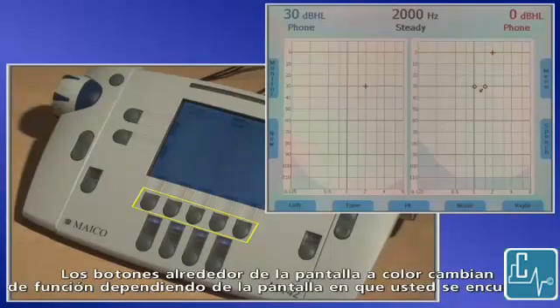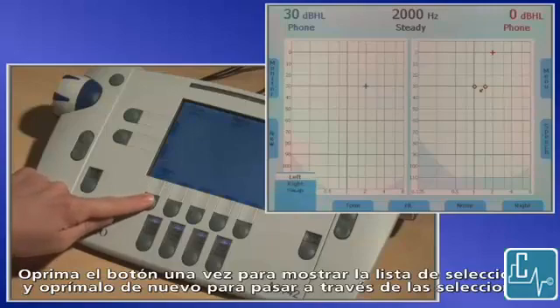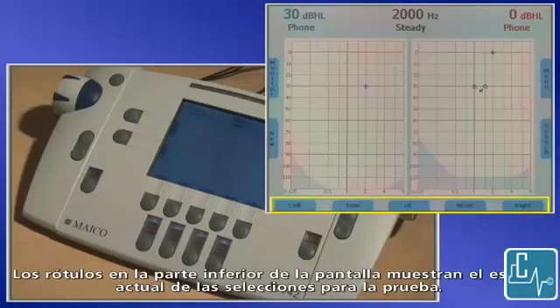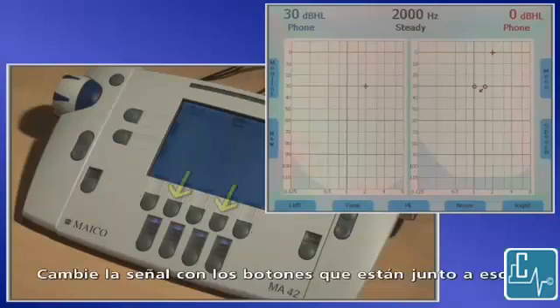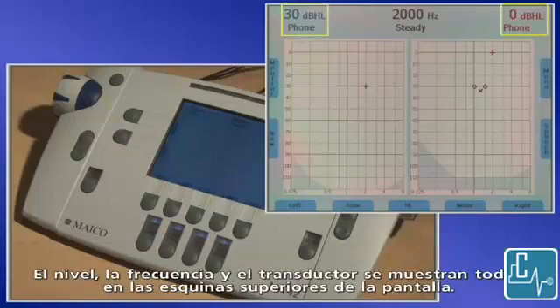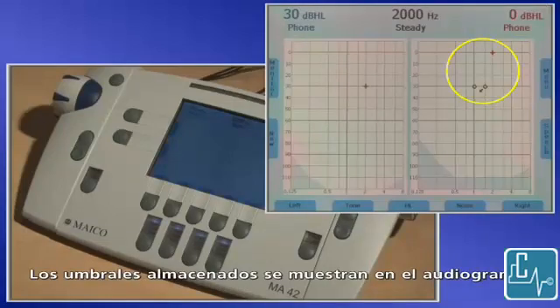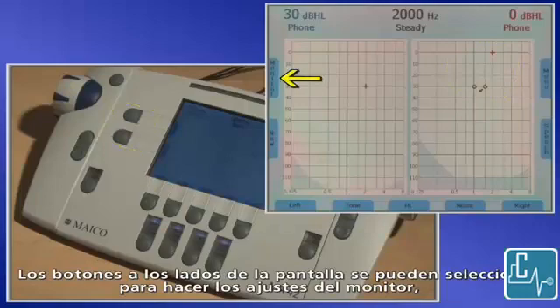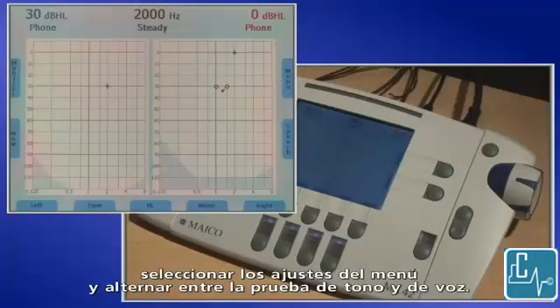Buttons around the color screen change function depending on the screen you are in. Press the button once to show the list of items and press again to toggle through the selections. Labels on the bottom of the screen display the current status of the test selections. Change ears with the two outside buttons, one for each channel. Change signal with the buttons next to those, again one for each channel. Use the center button to select the type of test conducted, which also affects the symbol that is plotted and stored. Level, frequency, and transducer are all displayed on the screen in the upper corners. Red or blue lettering indicates routing to the right or left ears. Stored thresholds are displayed on the audiogram. Buttons on the side of the screen can be selected to adjust monitor settings, start a new test which erases stored thresholds, select menu settings, and toggle between tone and speech testing.